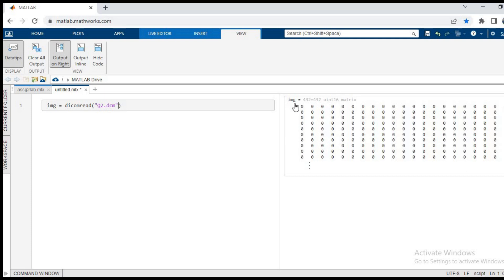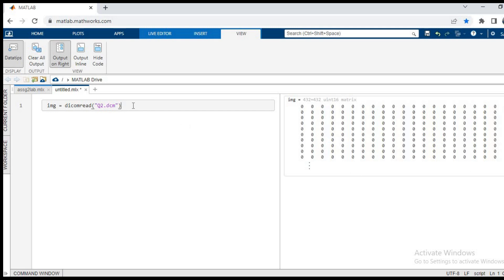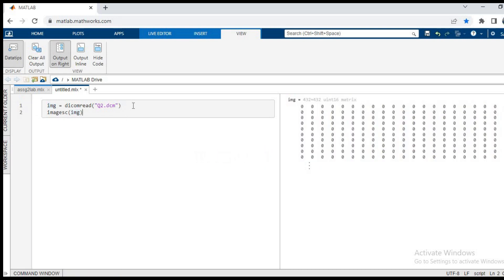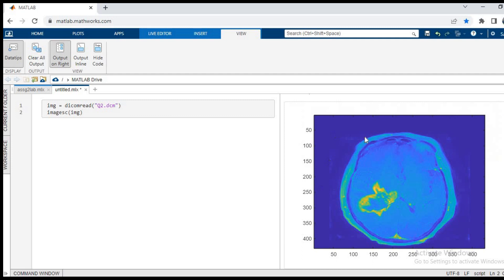Now let us see if this image can be displayed in the output matrix. For that we have the function called image sc. Remember that imshow function will not work in this one, so image sc bracket img and we use ctrl plus enter to run. As you can see, the image is now visible in the output folder.